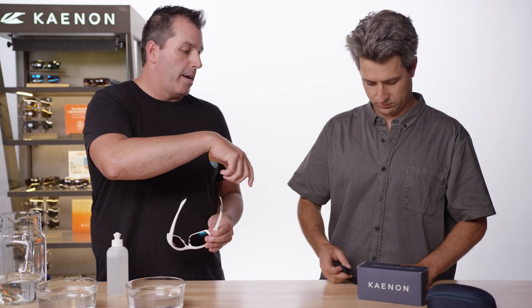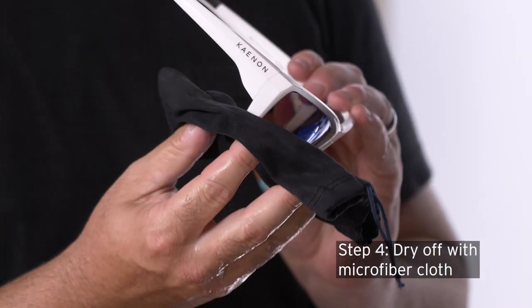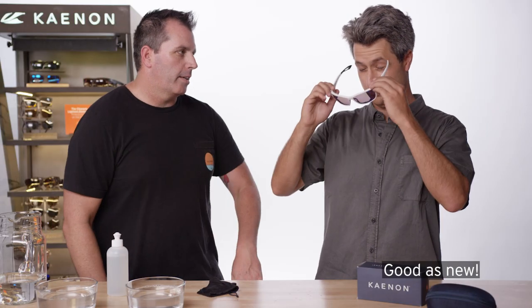Then the microfiber bag that your glasses come with — you want to use this to dry them. Not the shirt, not a paper towel, not any tissue. The microfiber bag. And if you don't have a microfiber bag, you could get a microfiber cloth. Then after you dry them, they should be super clean and super clear again, like they're brand new.